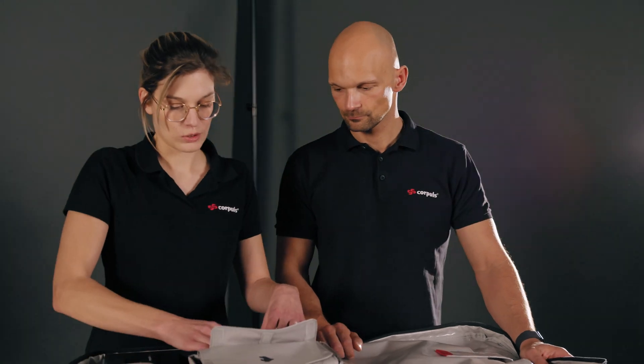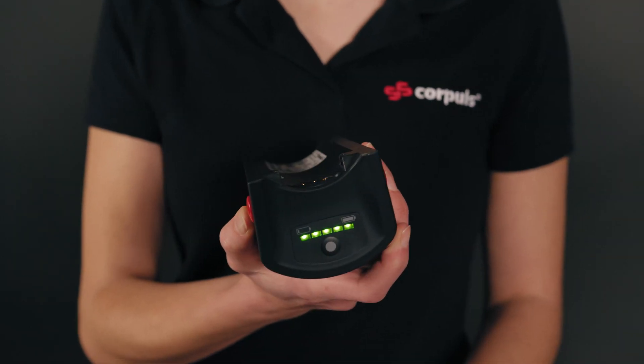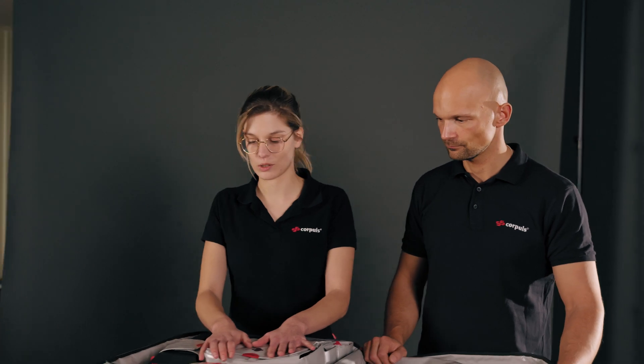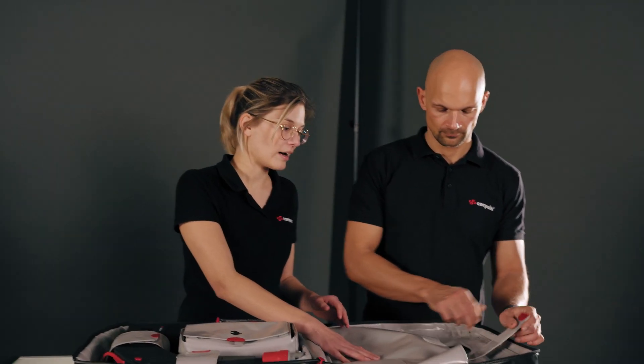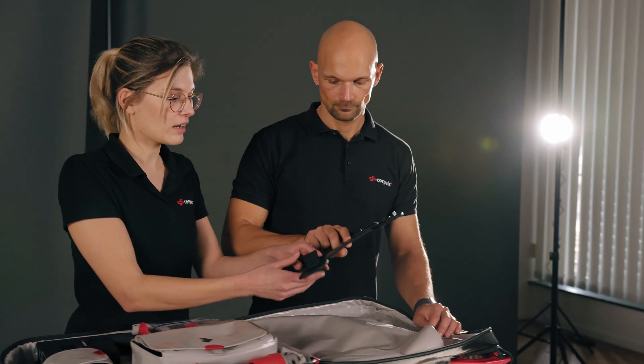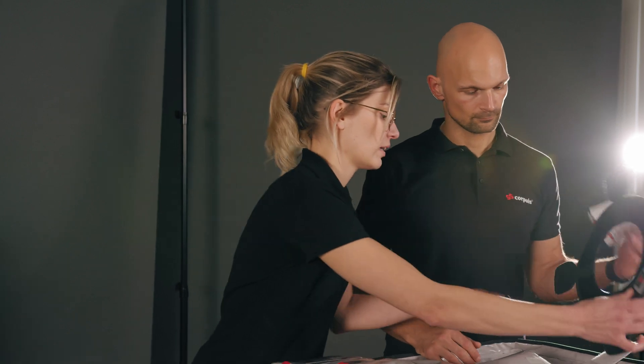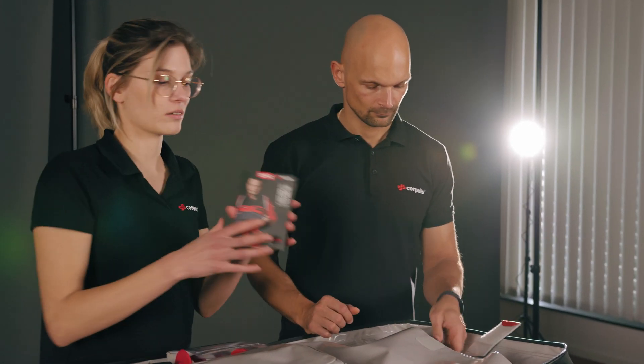The second bag holds a charged spare battery and the third bag holds the various power cords. We'll talk about that in more detail in energy management. On the top we find another compartment that houses the fixation ring, which is required for the Rec Board and the Scoop Board. We also have the pocket card outlining the four-step approach in here.